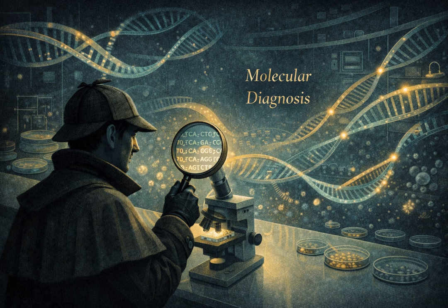Joetz calls this the gold standard for, and I'm quoting here, the clap and the chlamydia. He's not wrong. It's the technology behind the most common tests for Neisseria gonorrhea and C. trachomatis. TMA is different because it primarily amplifies RNA, not DNA. It uses a cocktail of enzymes, including RNA polymerase and reverse transcriptase, to simulate the natural biology of transcription. It's a self-sustaining cycle that produces billions of RNA copies very, very quickly, all while sitting at one constant temperature. And because the target is RNA, which is less stable than DNA, it's incredibly sensitive for detecting active living organisms. That's a key advantage, yes.